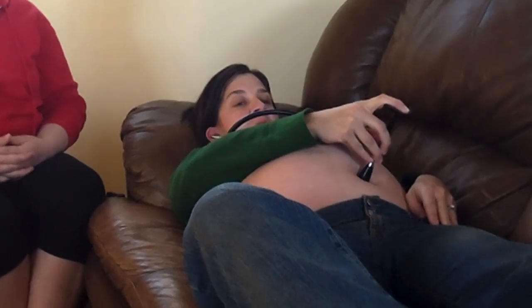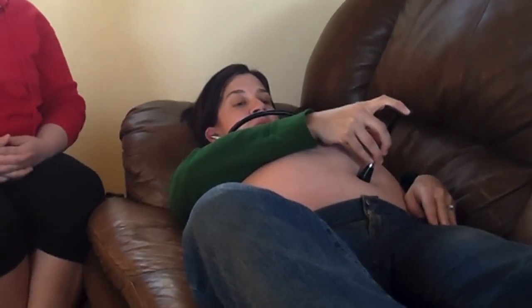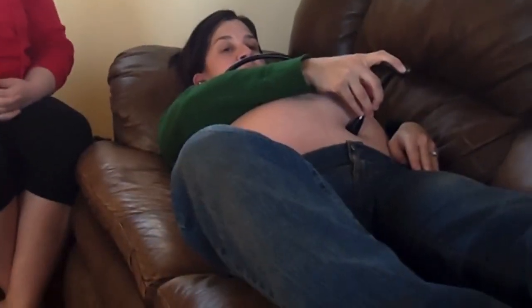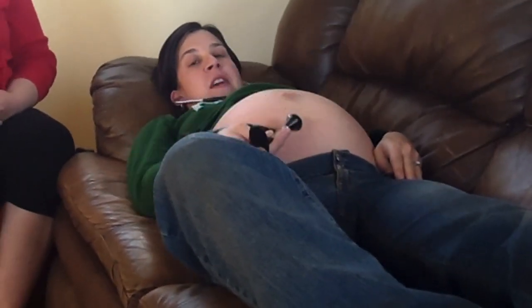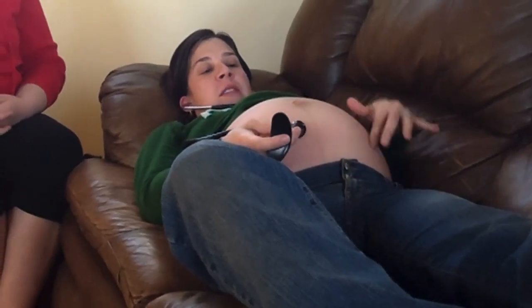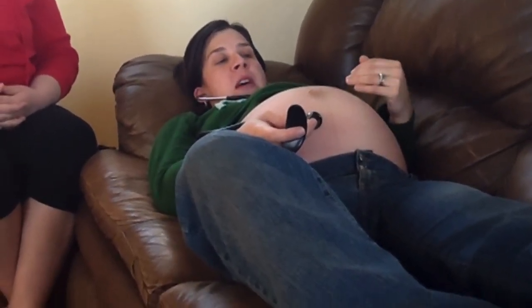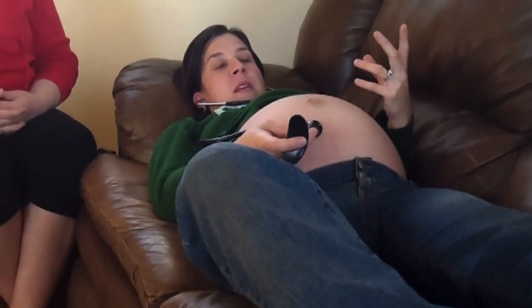Yep, there it is. Loudest about right here. And I can continue to hear it. The other sound that I hear is my placenta, probably about there. So that's my pulse. And I hear kind of a whooshing sound sort of above the baby's heartbeat.